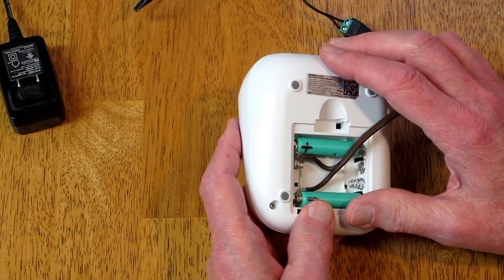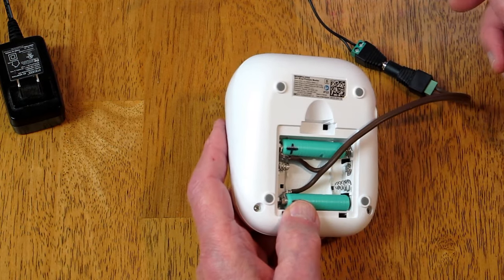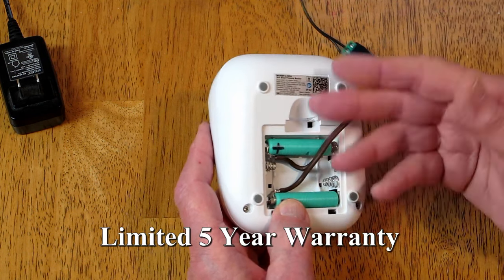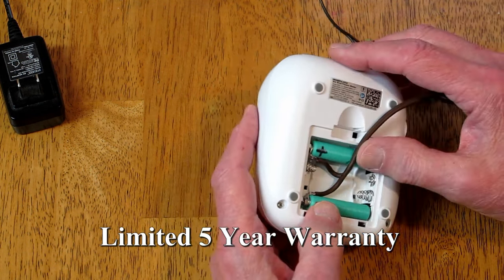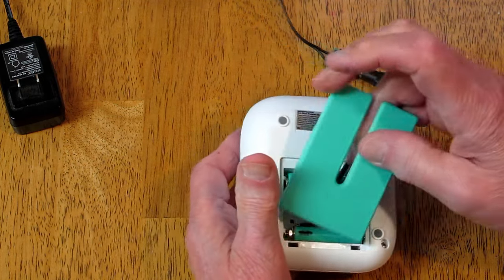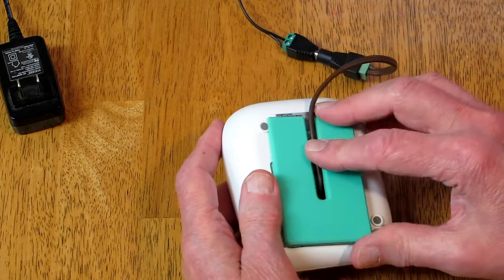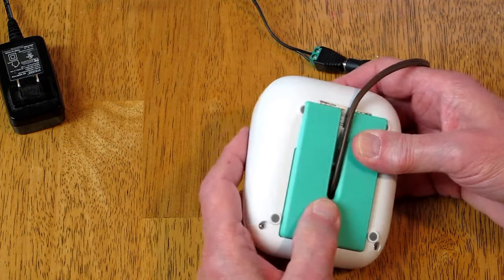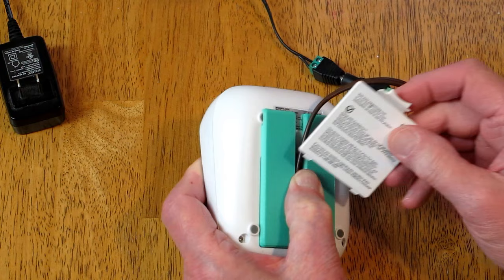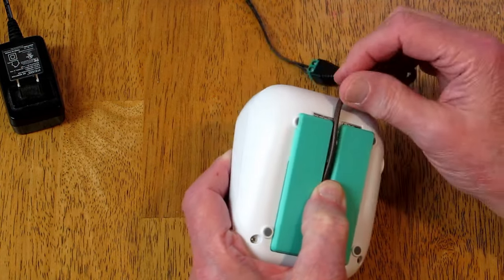I could take this apart and solder the wire directly to the circuit board where the battery box connects, but then if this thing dies within the warranty period I've altered the machine and that would void the warranty. By doing it this way — taping it in place and keeping it accessible — if this dies, my warranty is still good.